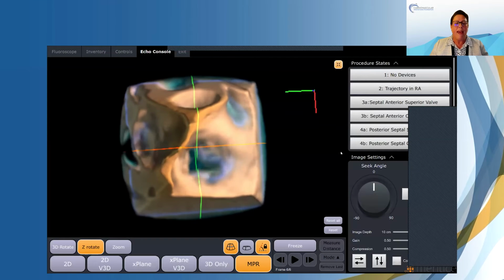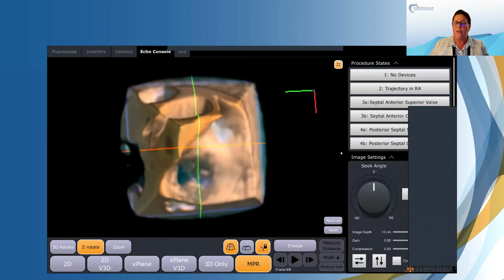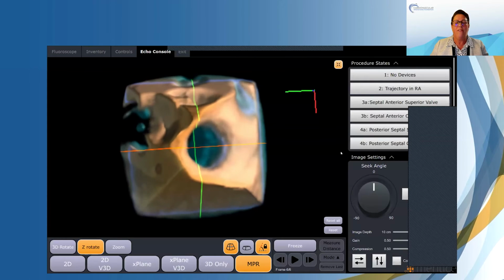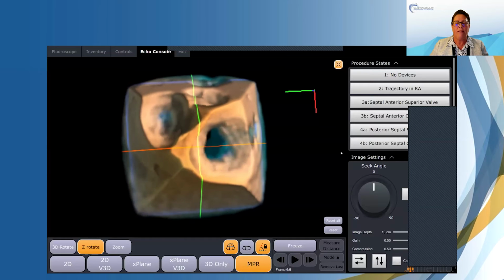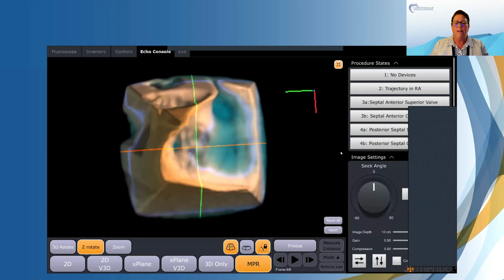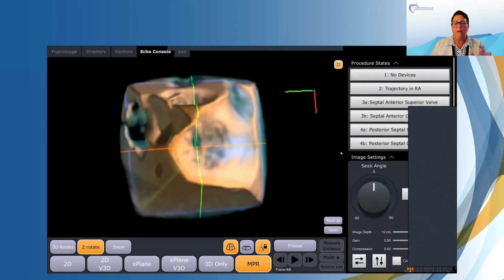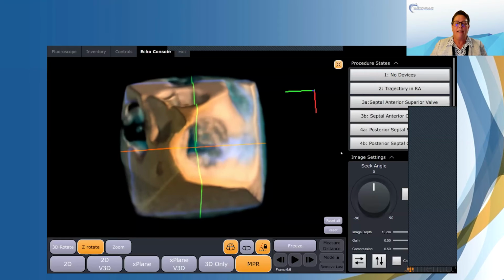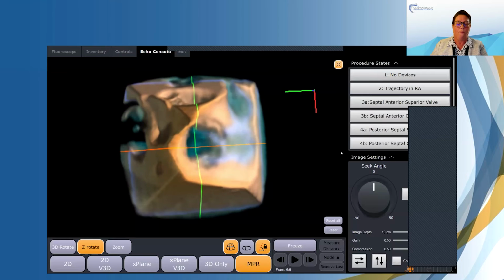So if I advance my catheter, we're going to notice that this X is going to go more towards the aorta. When I pull it back, this X will go more towards the IVC. If I clock, I'll move septally. And if I counterclock, I'll move laterally. So as you can see, just by turning on 3D, I immediately know how my planes are sitting over the valve. I can see how my adjustments to the catheter are moving my imaging planes.